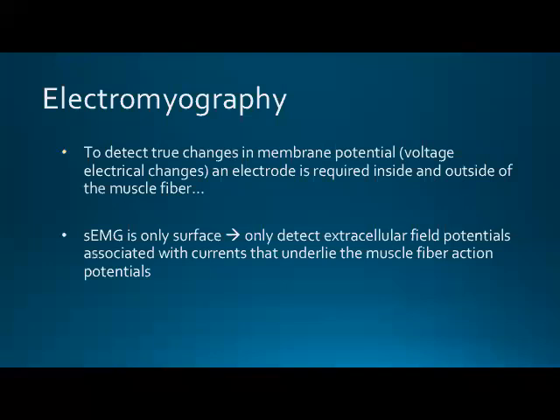Because EMG is, and this is the original interpretation, was that EMG measures the membrane potential. That's what the first inventors of it said it did. But in order to actually do that, think back to basic physiology, which we'll rehash again in our next section, that you have your membrane, you have your axon, and a potential is created because of a difference in voltage from the outside and the inside, right?